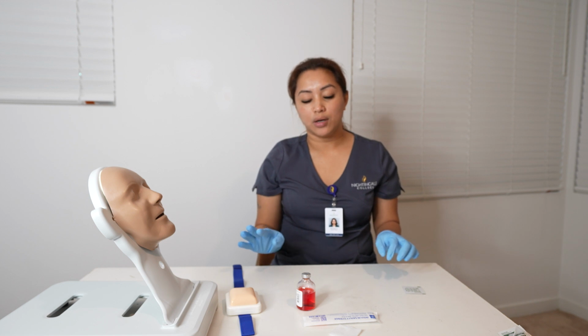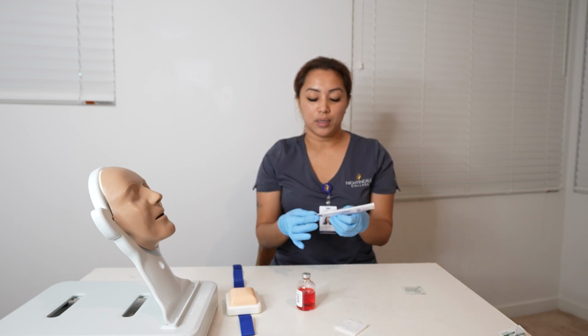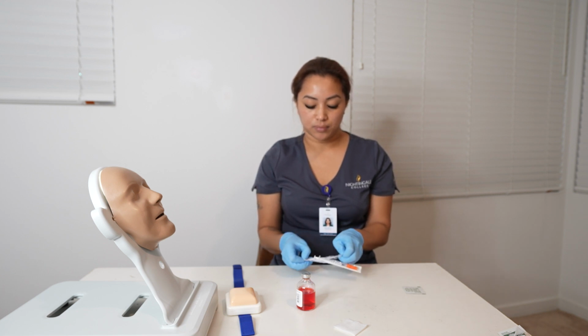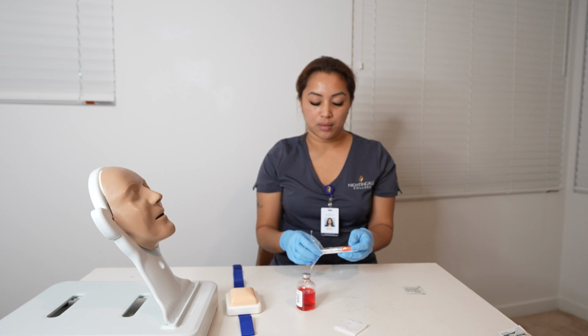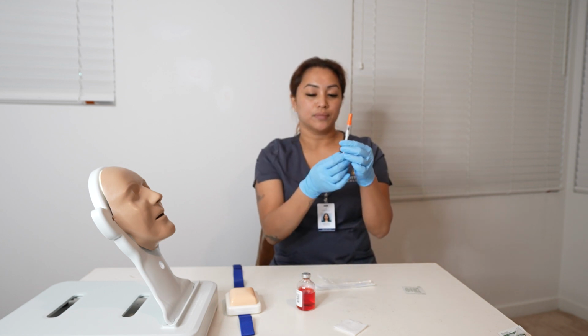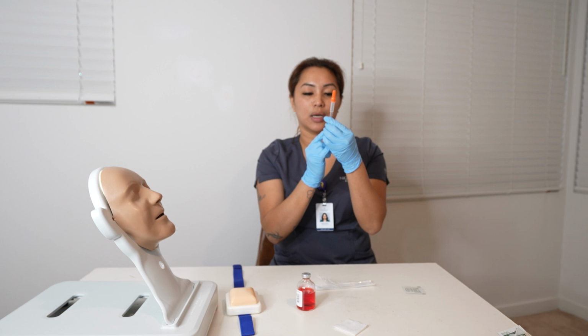While we are letting that air dry, we are going to open the syringe package.